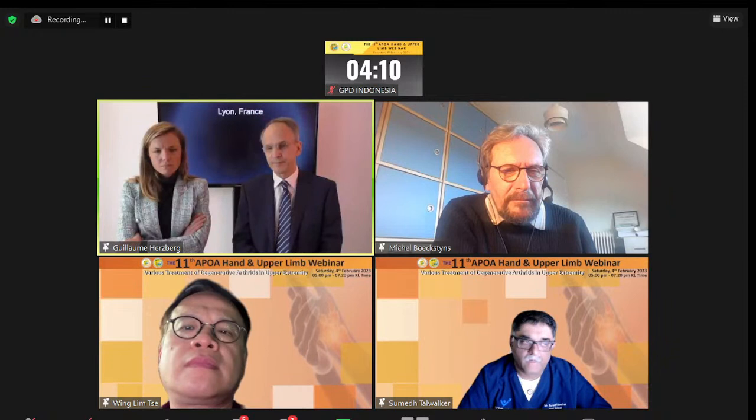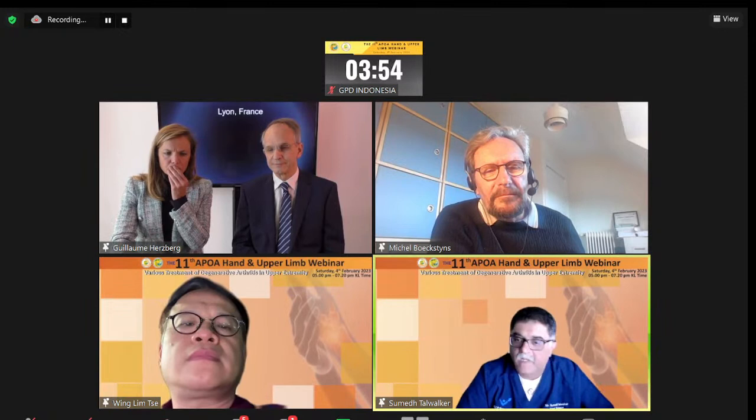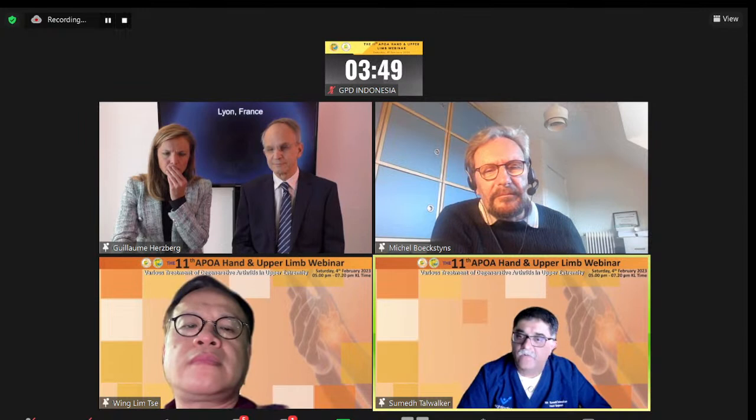Thank you. I think that takes us neatly to the next topic, related to something like the MoTeC, which allows a lot of degrees of freedom. If you were to do something like the MoTeC wrist replacement, which has found a huge market share, particularly in the Far East and Australia, you would find that they would fail. I think that's a very important take-home message because it tends to be looser within rheumatoid patients. So you'd probably prefer something like the Remotion and the Universal.